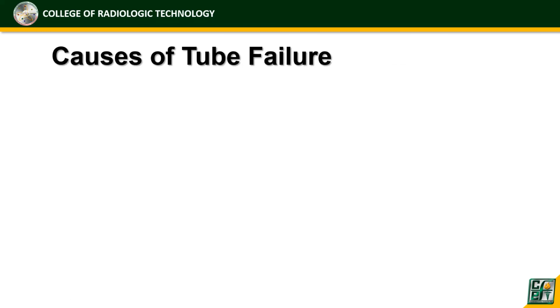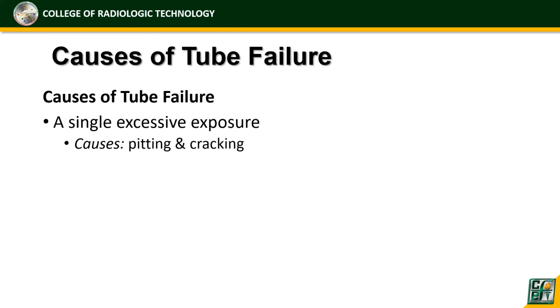Then what are the causes of tube failure? Tingnan natin. A single excessive exposure. Yung mataas na technical factors in a single exposure. Mataas na yung mA mo, mataas na yung kV mo, mataas pa yung time mo.